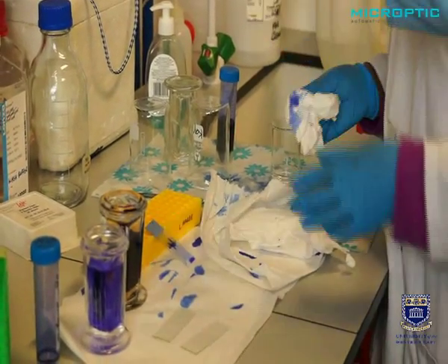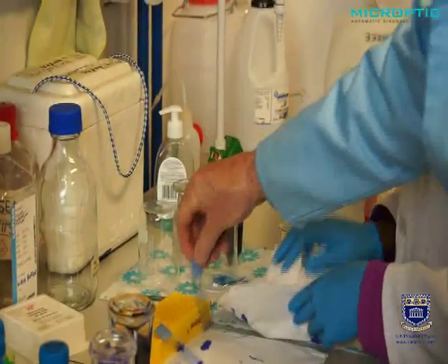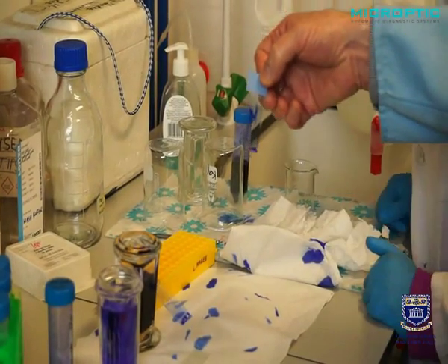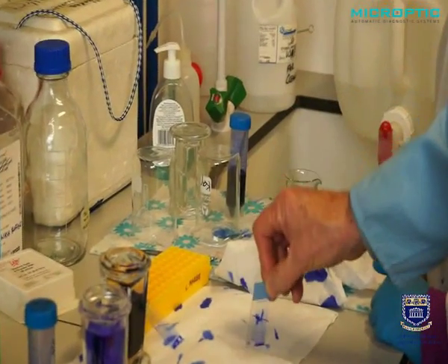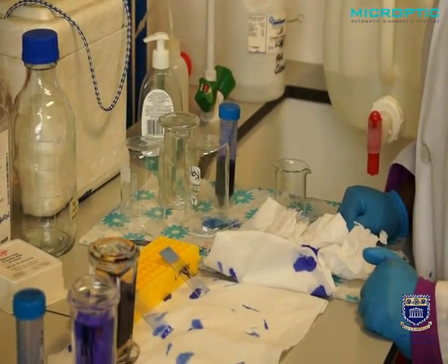And you can see that is a very nicely stained slide. This one, maybe there was too much sperm, too much seminal plasma proteins there, and maybe it's not a good one to use at all. Perhaps stain another one.